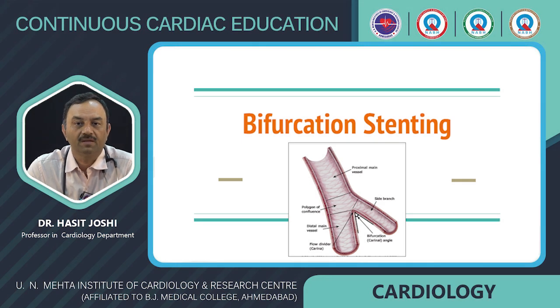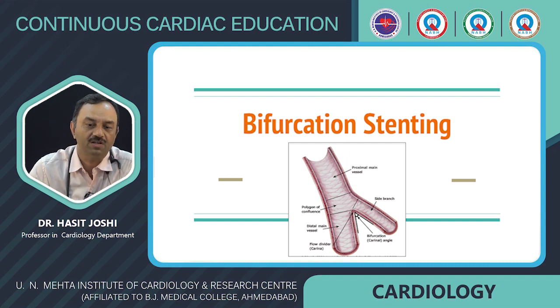Lesions are very common, and due to flow turbulence, atherosclerosis tends to occur at bifurcation sites. About 20% of all coronary lesions are bifurcation lesions, and hence knowing it is more important. The bifurcation techniques are varied, and there was no standardization previously. However, now it is proposed to have a standardized reporting of bifurcation procedures.